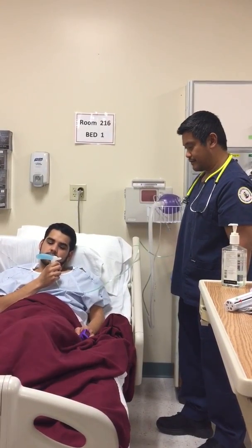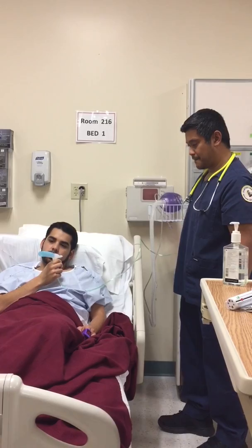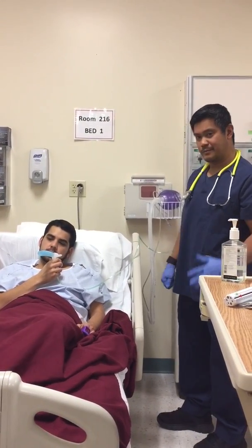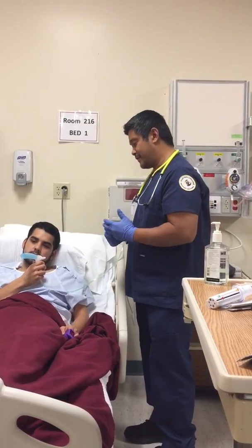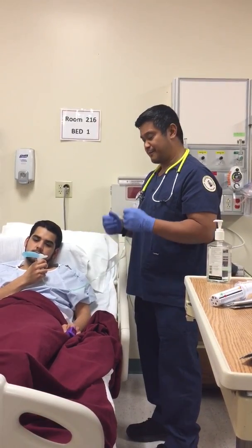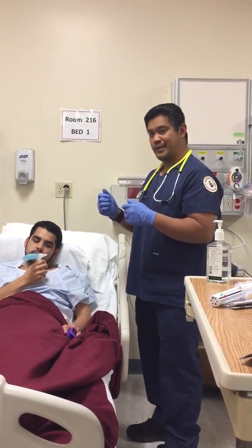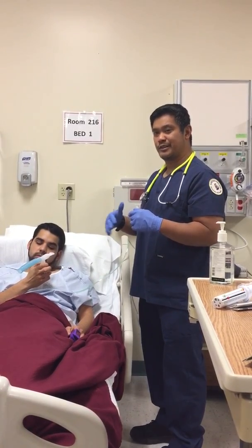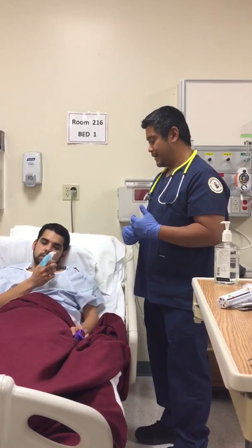All right, Christian, doing great. I'm going to say it's been about 15 minutes. The device would start to sputter, and you can probably just go ahead and flick the cup a little bit. If there's any other medications inside there, that'll loosen it up and allow it to flow.